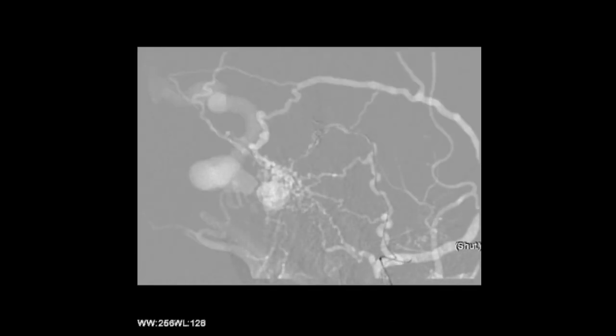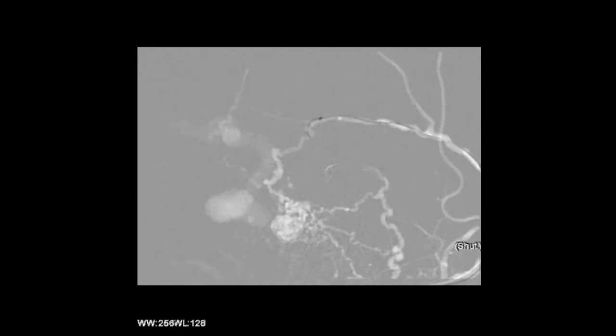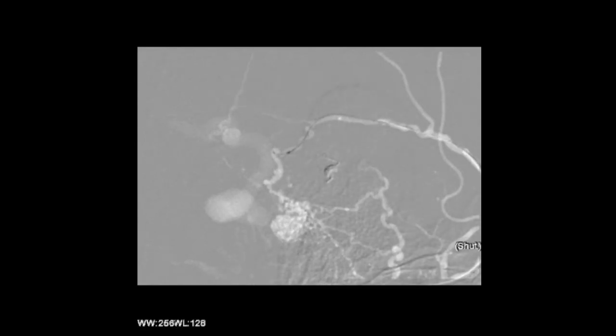Now another microcatheter, again a Marathon 1.5 French, is taken into the middle meningeal artery, posterior division. Again, this was also quite a tortuous artery. We used the access of a 5F Envoy to place this microcatheter there. Again, sometimes these loops can be quite challenging to navigate, and we did use a Synchro 10 microwire, which tends to torque better, and we were able to navigate these loops and reach the fistula site.